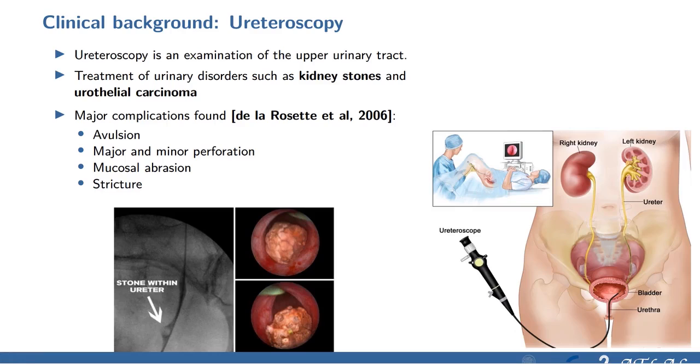Even though this procedure is very safe, there is still a chance that some complications could arise. The most common ones found were avulsion, major and minor perforation, mucosal abrasion, and stricture.